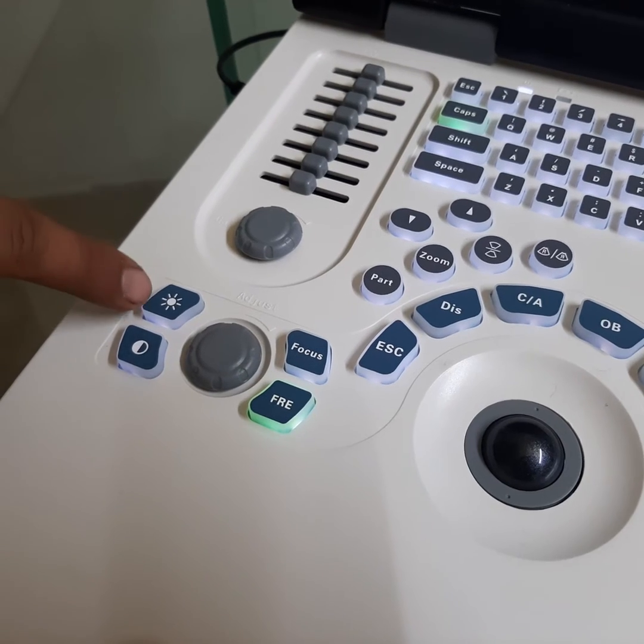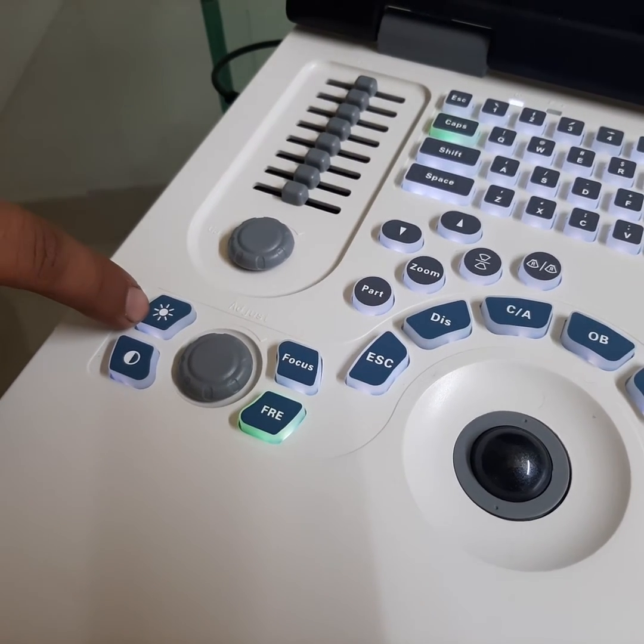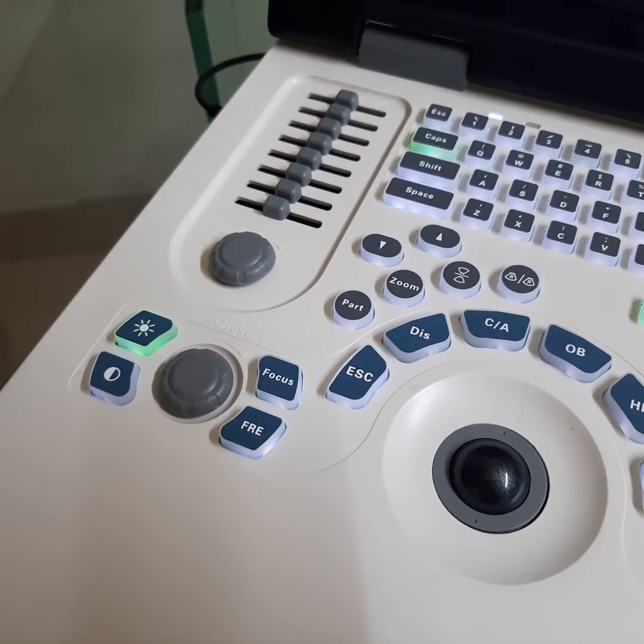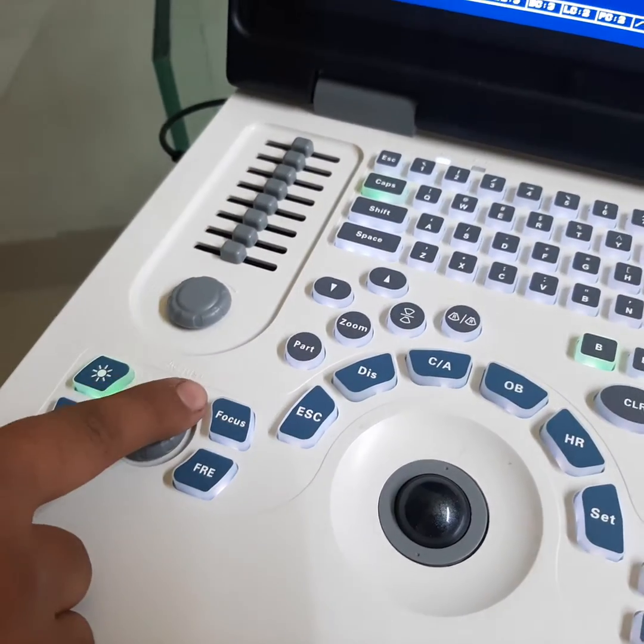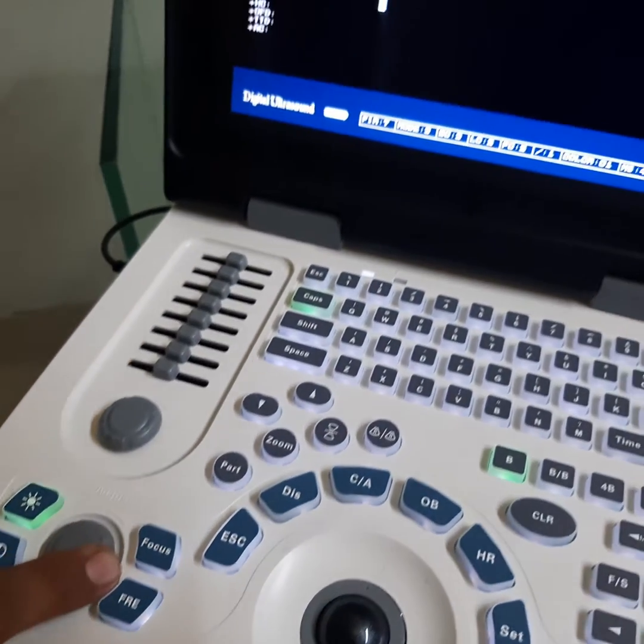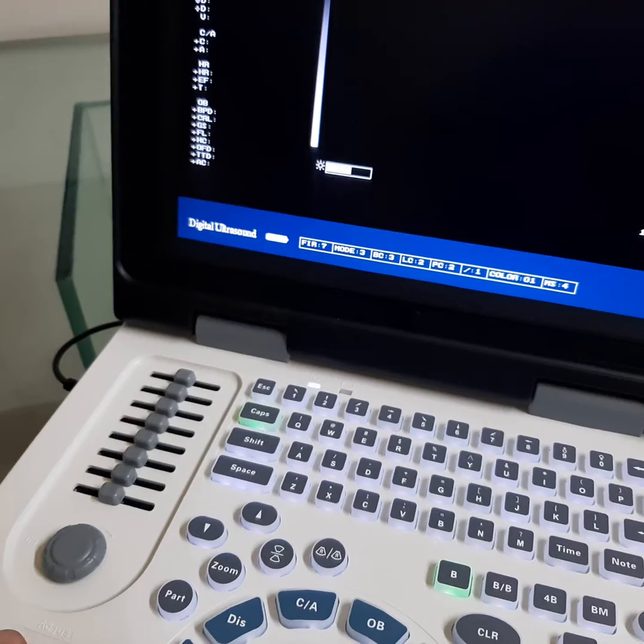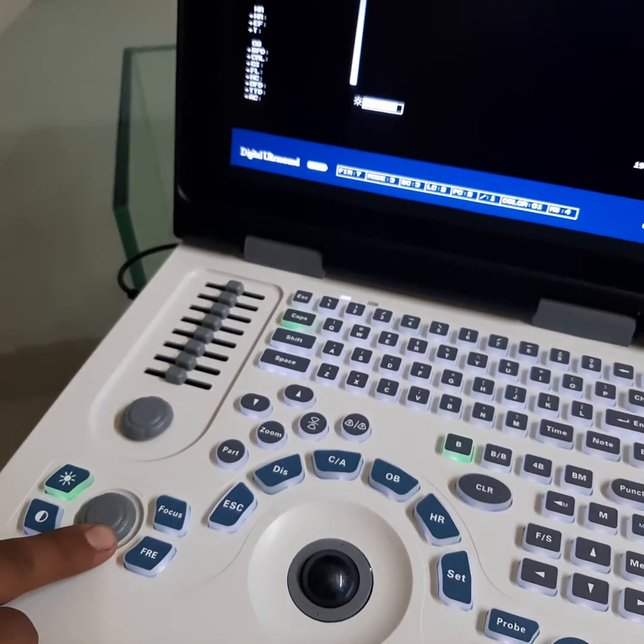Press this button for brightness of overall image. Press left for increasing the value, right for decreasing the value of brightness.